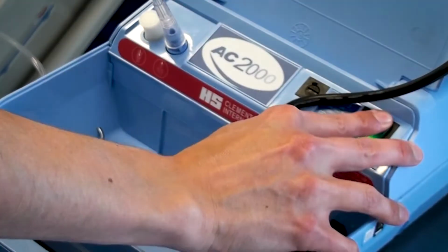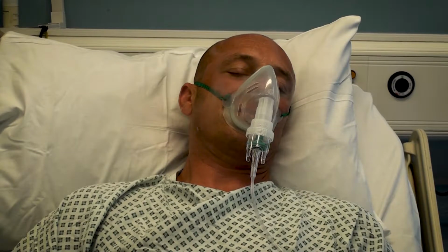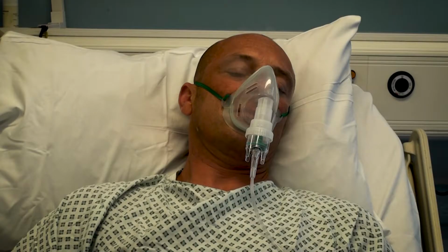turn on the oxygen or the compressor, and then deliver between 6 to 8 litres of oxygen. Ensure that the aerosol vapour is being produced effectively and instruct your patient to breathe normally and avoid talking whilst the treatment is taking place. Document appropriately on the prescription chart that the drug has been delivered, and periodically during the procedure check on the patient to ensure that they are well.